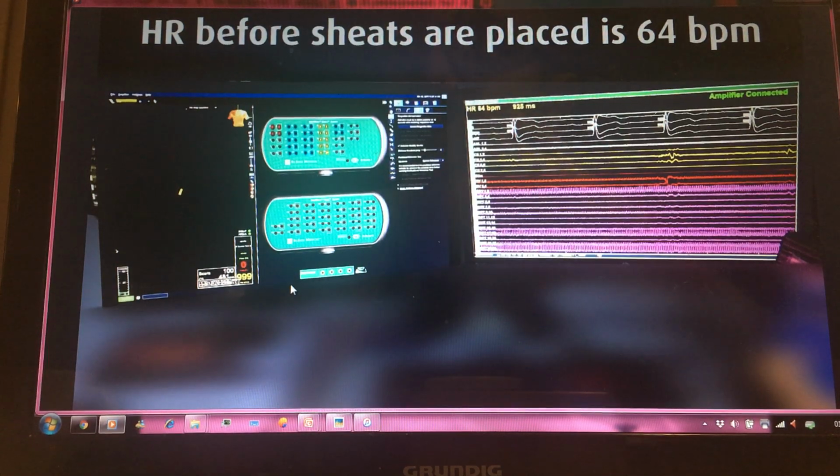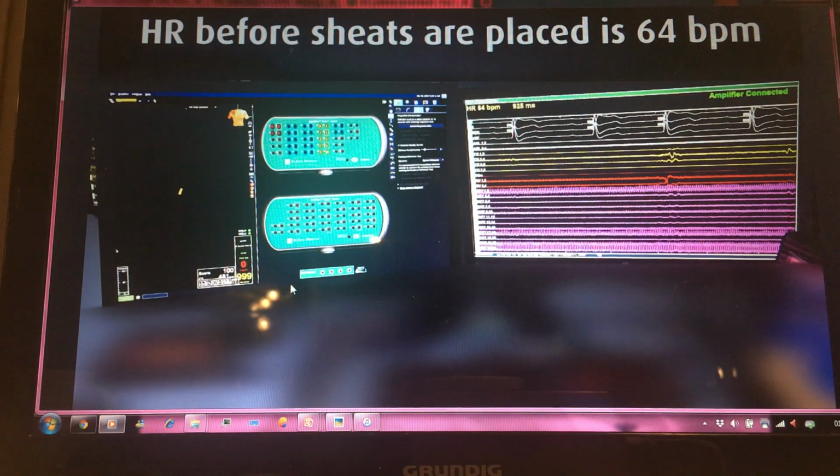In this case, before the procedure, we checked the basal heart rate, and in the ECG his resting heart rate was nearly 60 bpm. Then we administered 2 milligrams of atropine to demonstrate the atropine response. After atropine administration, heart rate increased from 60 to 110. So in this patient, after the procedure, we will try to achieve this heart rate response to confirm complete vagal denervation.